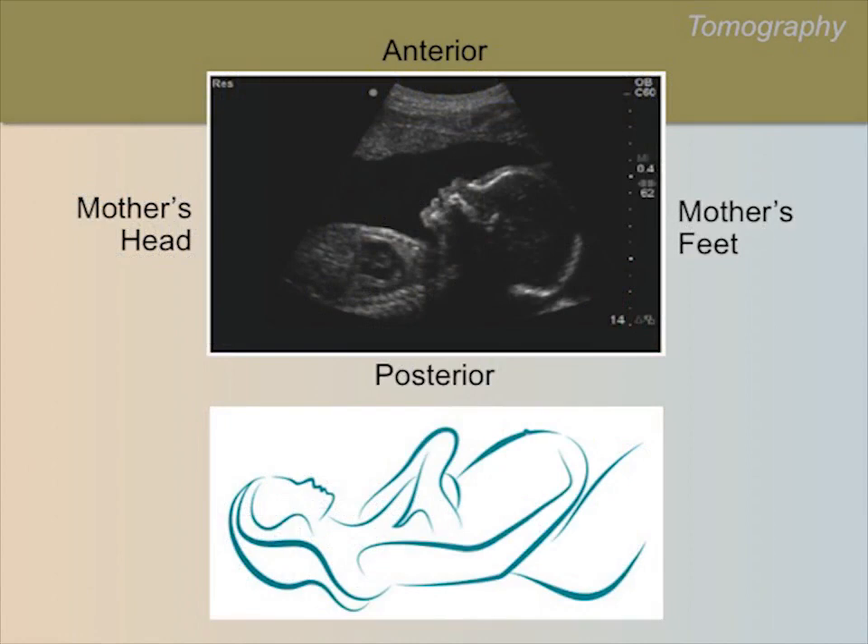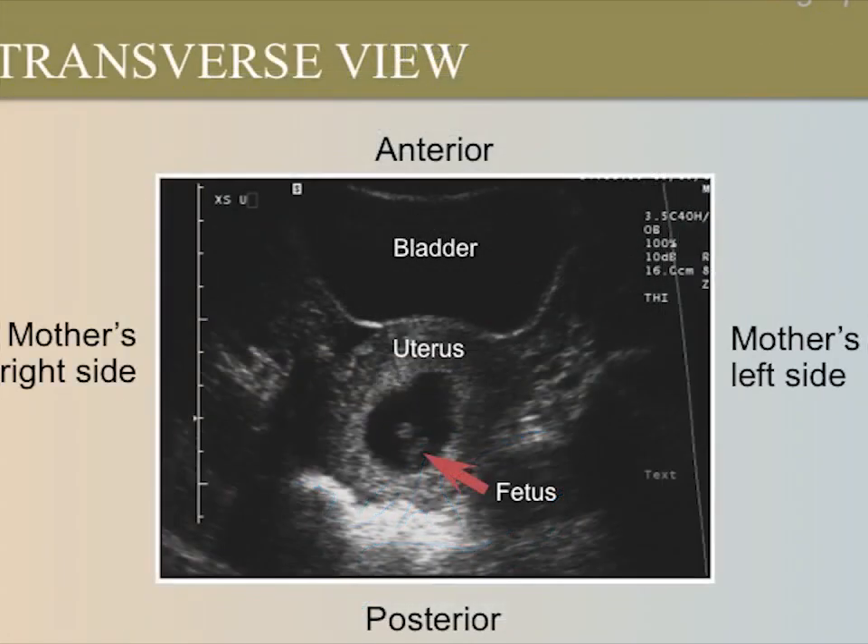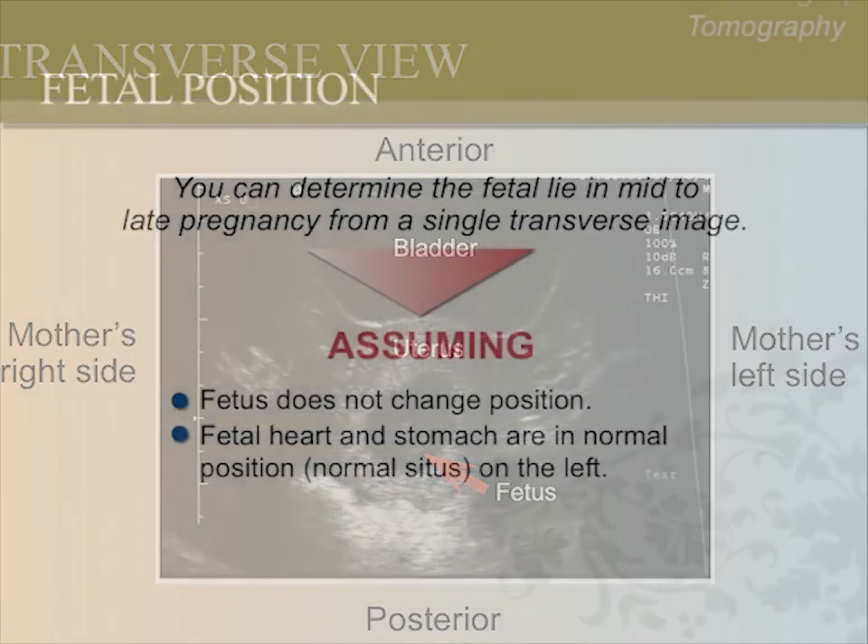Now let's apply these terms to an ultrasound image. This is an image of a fetus that is head down — a longitudinal lie and more specifically a cephalic presentation. Standard practice is to have the mother's head on the left side of the screen and her feet towards the right when scanning. Therefore, a fetus with a cephalic presentation has its head towards the mother's feet. When looking at a transverse scan, imagine that you are at the patient's feet looking towards her head. Notice the anterior side of the patient is at the top of the image and the posterior is at the bottom. The mother's right side is on the left side of the screen and her left side is on the right side of the screen.